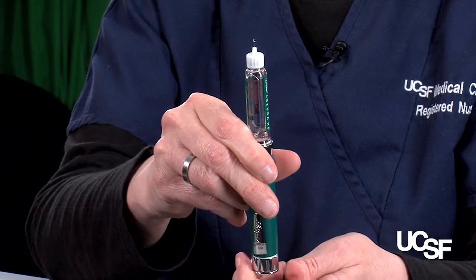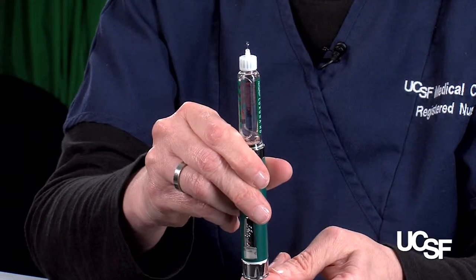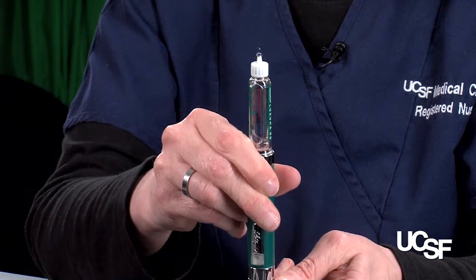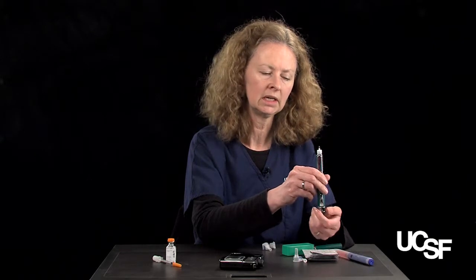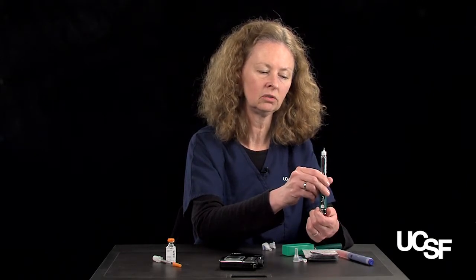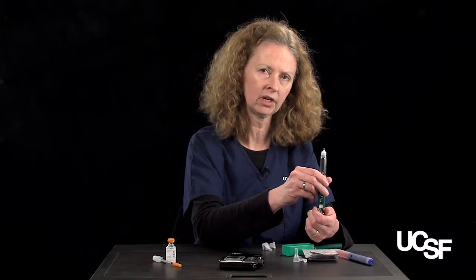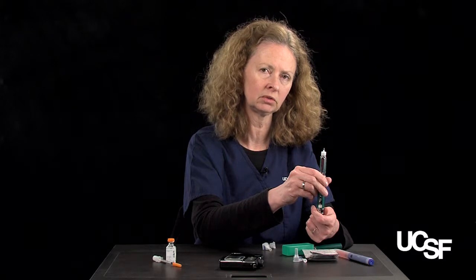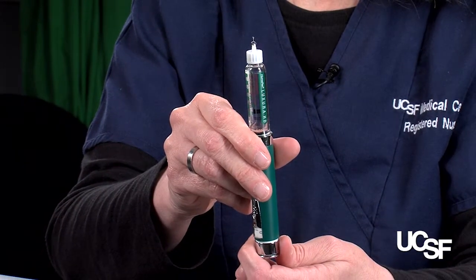That was 1.5, so let's do that again. 2 more units. We want to see at least 3 drops of insulin. So that's a successful air test. We know that this pen's going to work. Now we can dial our dose. If you listen to the clicks, you can hear how much insulin you're dialing. This is very helpful for people who have visual impairments, who can't see a syringe, or who have dexterity problems. So if you listen, each click is 1/2 of a unit.